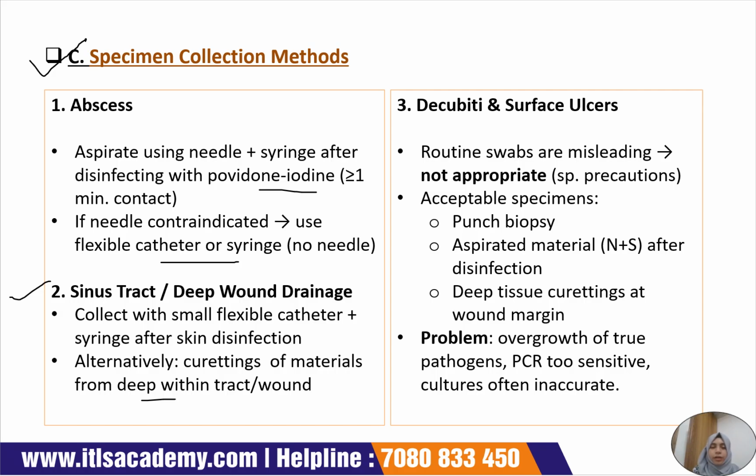For decubitus and surface ulcers, routine swabs are misleading. That's why they are considered inappropriate, but they can be considered with special precautions.